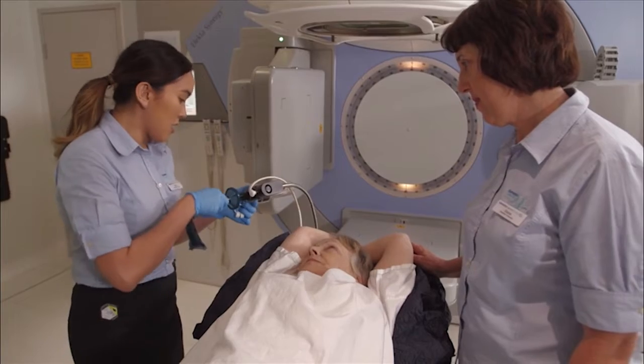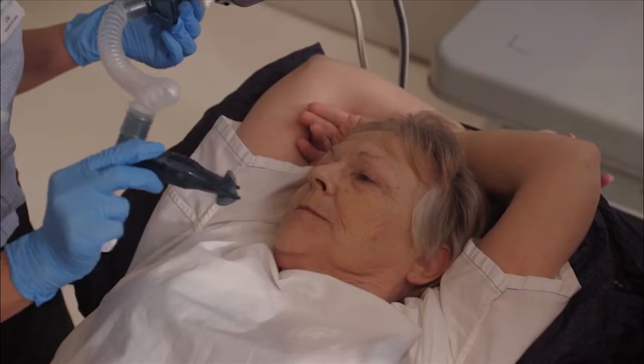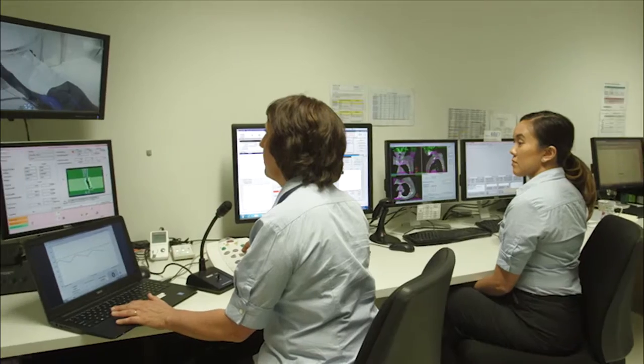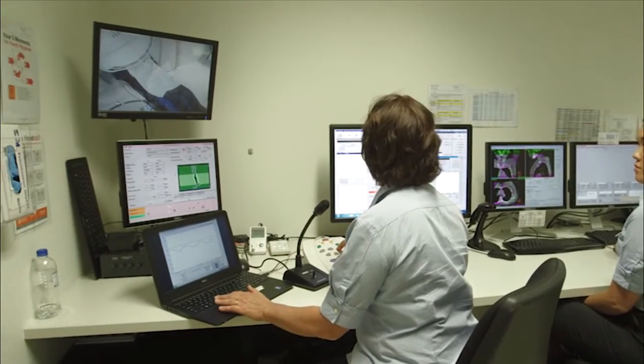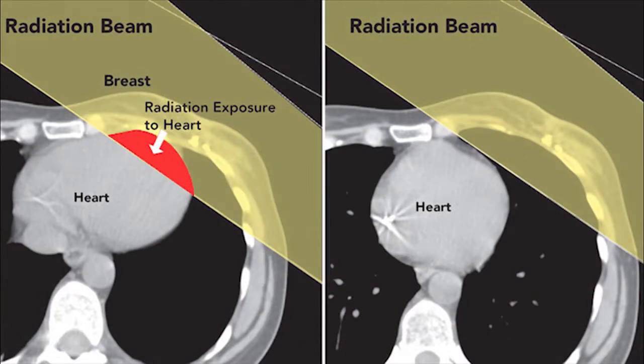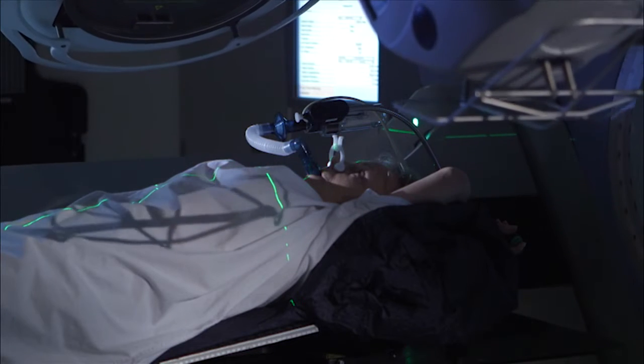DIBH requires you to hold your breath during your CT scan and each daily treatment. You need to be able to hold your breath for a short period of up to 20 seconds, several times during each daily treatment. When you hold your breath, your chest is expanded and your heart is pushed down and away from your chest wall. This process helps minimise the dose to your lungs and heart during your daily treatments.